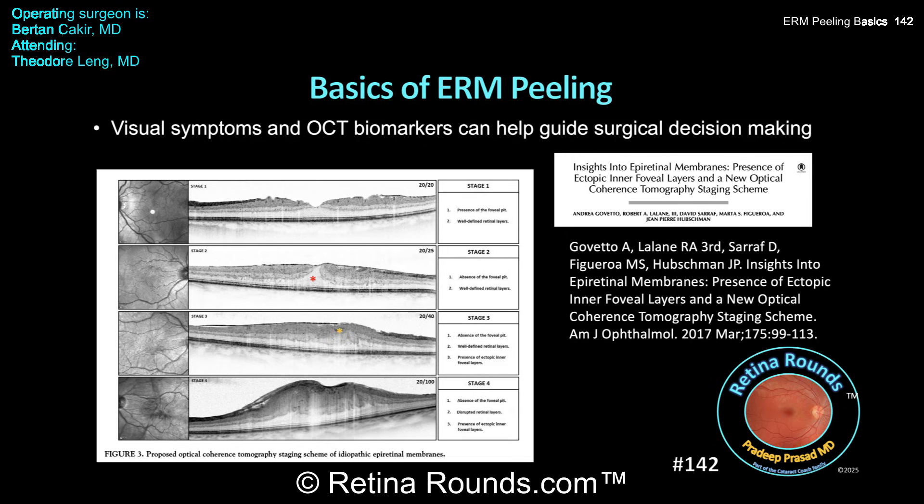A stage 1 ERM demonstrates a normal foveal contour, normal inner and outer retinal layers, and no ectopic layers over the fovea — meaning at the fovea we see the outer nuclear layer without overlying inner layers like the inner nuclear or inner plexiform layer, which is normal anatomy. A stage 2 ERM shows flattening of the foveal pit, but still well-defined retinal layers and no ectopic inner foveal layers. You can see elongation of the outer nuclear layer, highlighted by the red star. Stage 3 ERM is where we can start to see ectopic inner foveal layers, though retinal layers themselves are still well-defined.